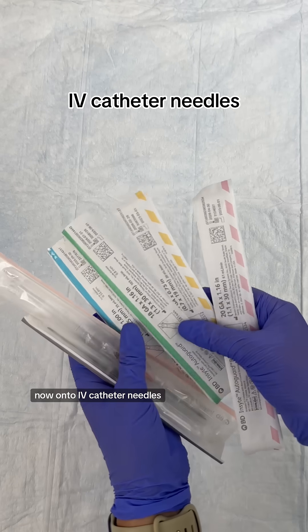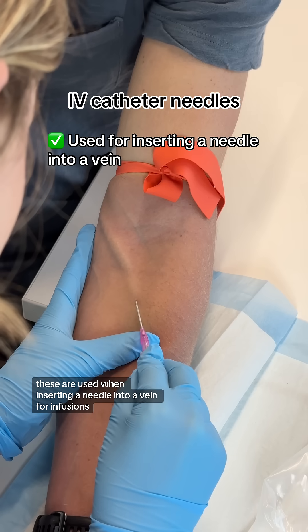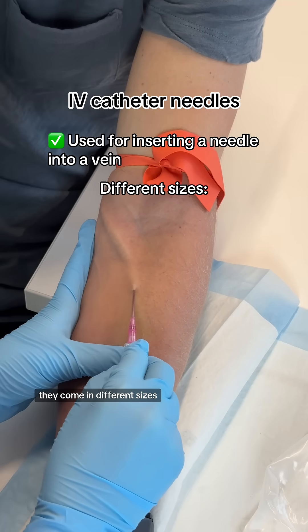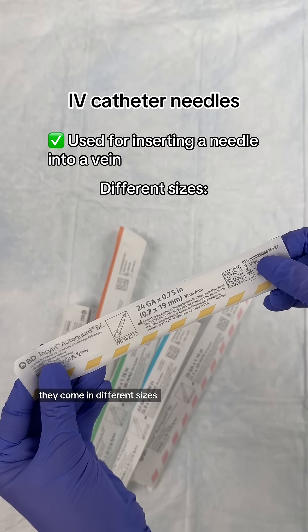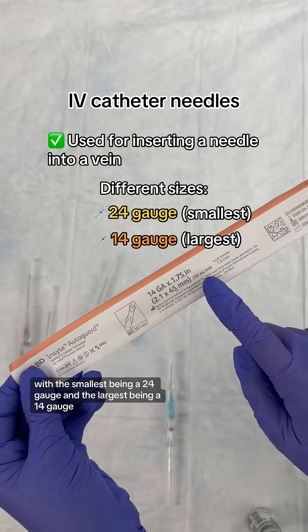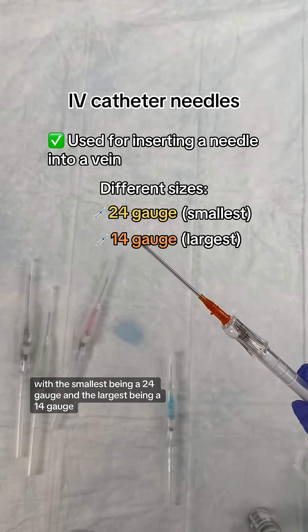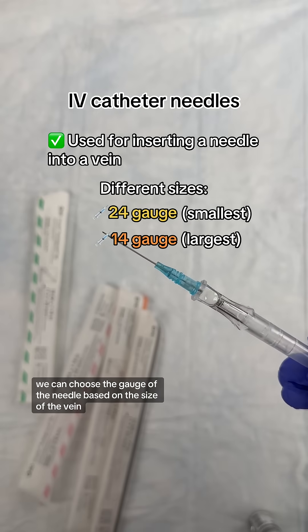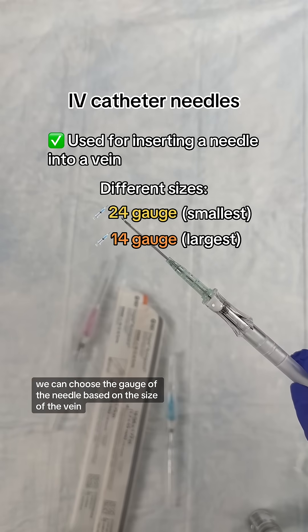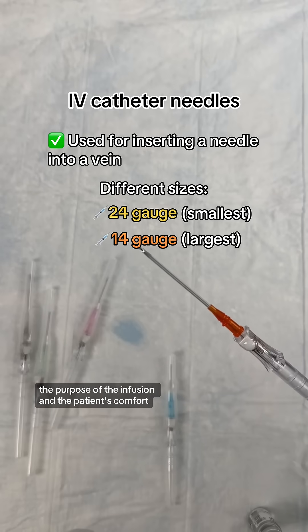Now on to IV catheter needles. These are used when inserting a needle into a vein for infusions. They come in different sizes, with the smallest being a 24 gauge and the largest being a 14 gauge. We can choose the gauge of the needle based on the size of the vein, the purpose of the infusion, and the patient's comfort.